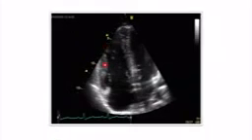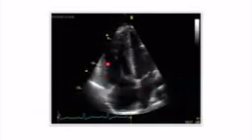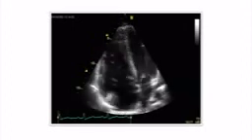When we want to assess function, well, you have to look at the longitudinal motion of the free wall of the right ventricle, because the right ventricle contracts differently, uses this contraction instead of radial contraction, which is typical for the left ventricle. And here, as you see, this motion is reduced. Look, for instance, at the example on the left, where the right ventricle, apart from being dilated, is not functioning well because this motion of the tricuspid annulus during systole and diastole is reduced.